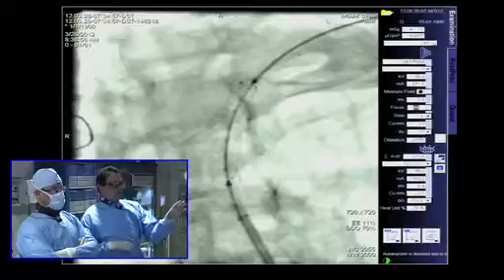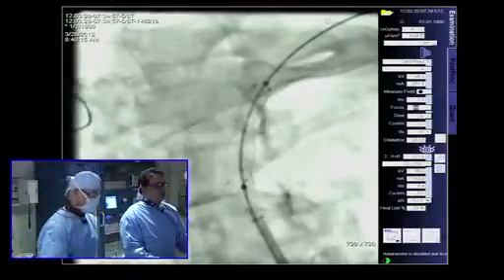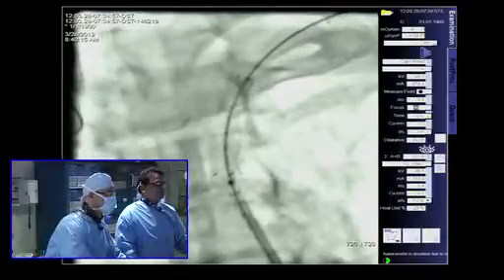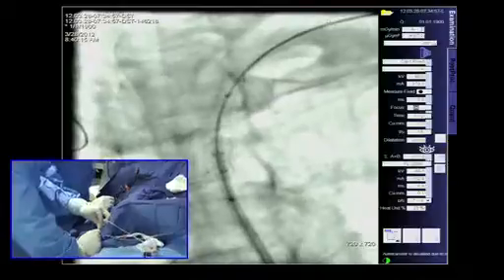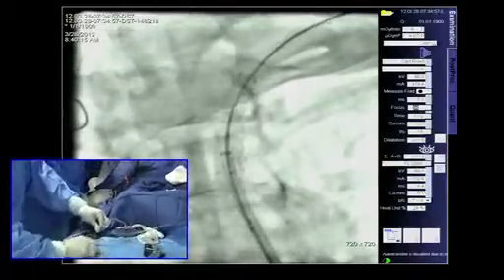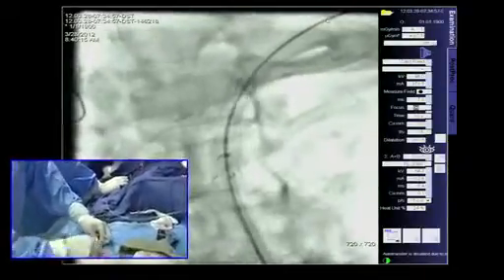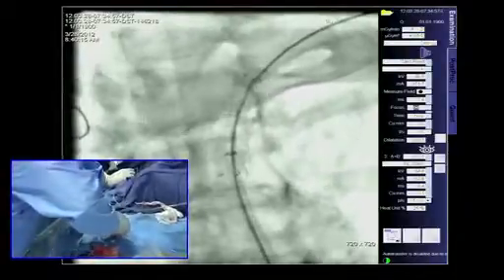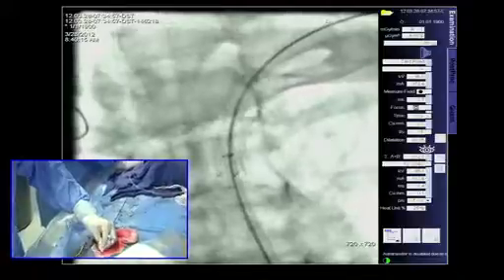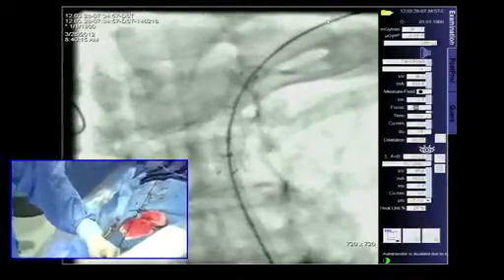So now that we've balloon inflated, I'm going to go ahead and pull my sheath in a little bit. I'm going to have Dr. Wiley walk this out very, very slowly. It's a very important technique. Now you see that the sheath is going a little bit in the subclavian over the balloon in order to be able to take high-grade selective pictures as well as to advance further equipment if needed. As you see here, we may need a little bit more expansion, maybe even with a 6 balloon in the middle there, but we'll see about that.